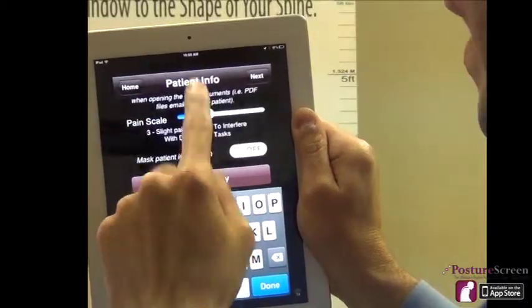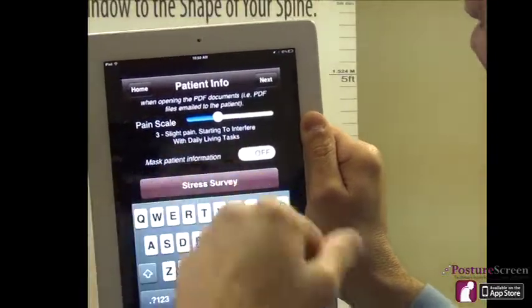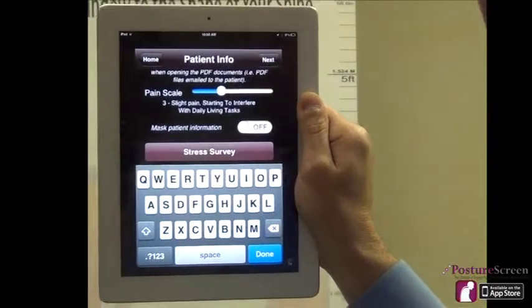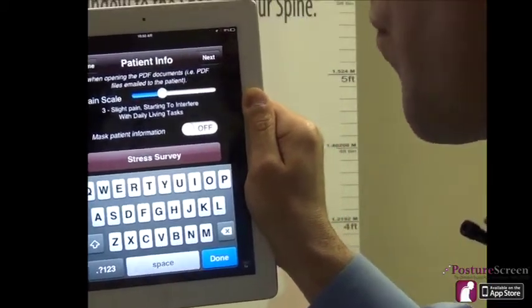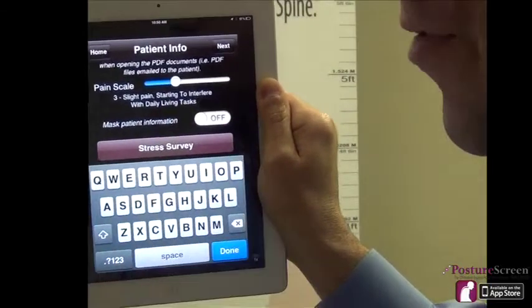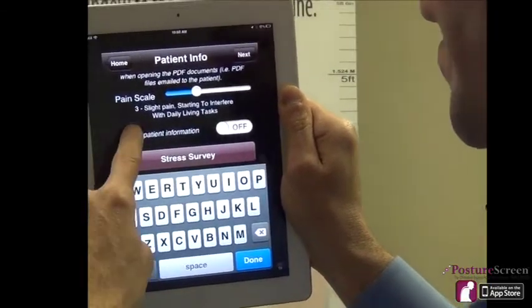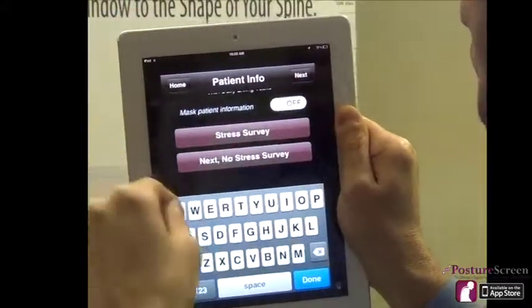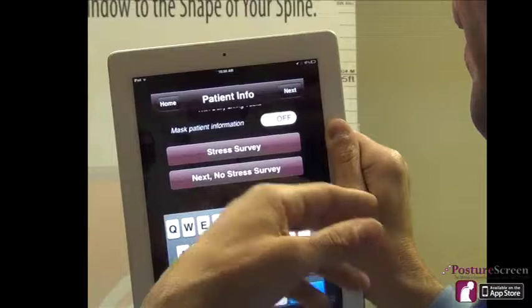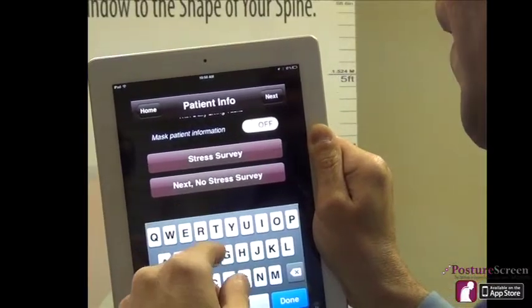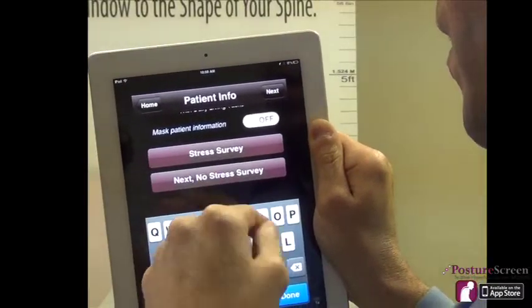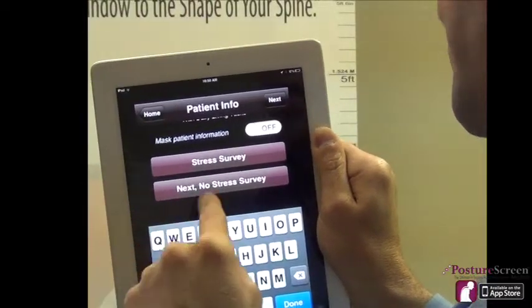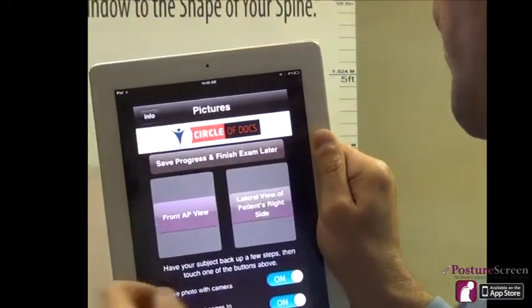We can also do their pain scale — the toggle for the pain scale is optional. Some doctors don't want to record pain, so we can now hide that from the report and it won't gather any information on the pain scale. We can also still mask the information if we're projecting, and we can do the stress survey, but I'm going to go ahead and say no stress survey for now.